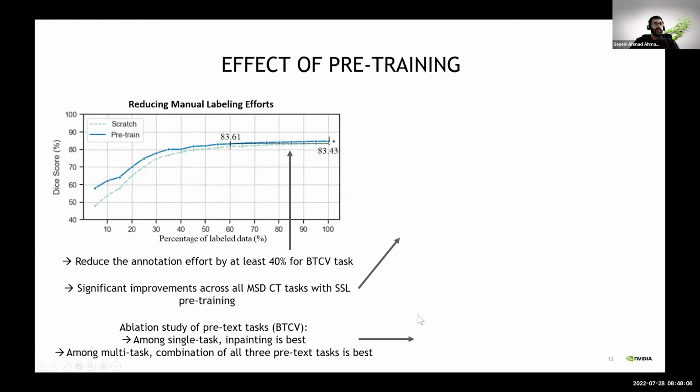There's also a very nice ablation study in the paper of SWIN UNETR. First of all, it analyzes how much the percentage of labeled data in the BTCV dataset matters, with only 10% of labeled data up to 100%, which is basically the 24 volumes in the training data, because BTCV is actually not a very large data set.